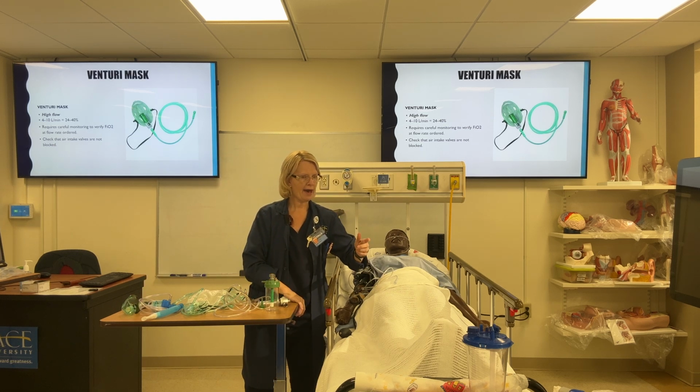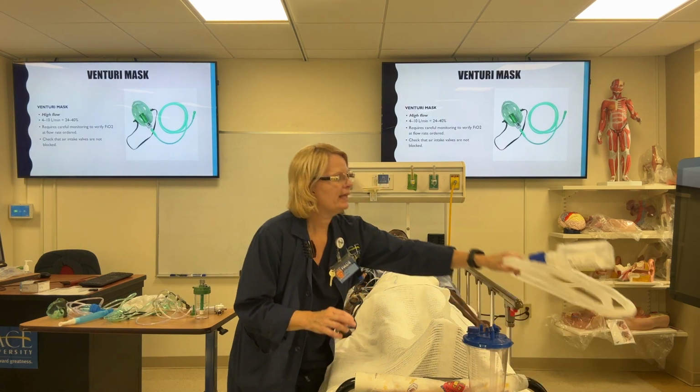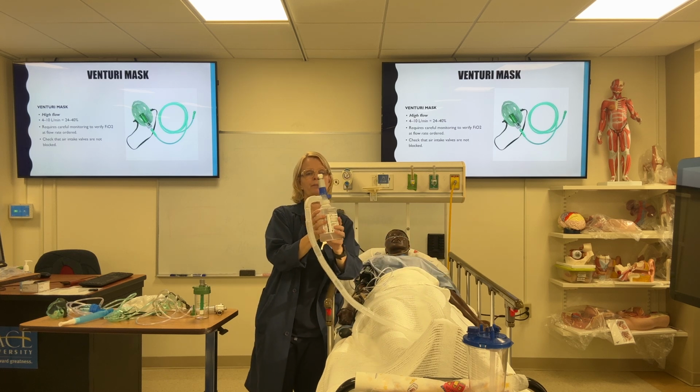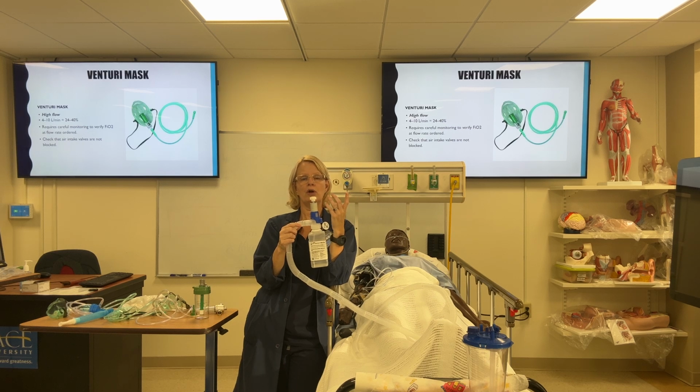And we also have something that we can use for patients that can also control the percentage of oxygen we're giving. This is a humidified device, meaning that, let's say I want to put my patient on humidified oxygen. What does that mean?